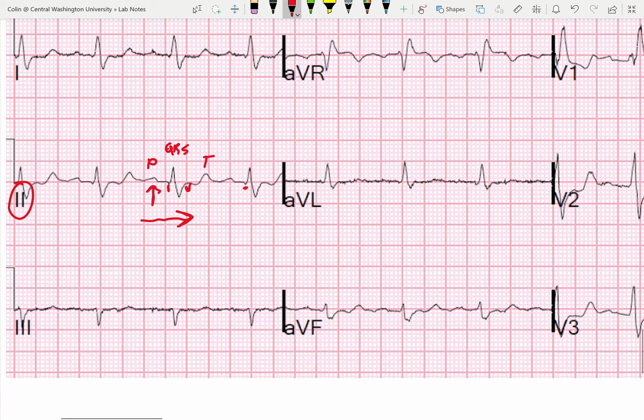The Q wave is just super small. So if you said all I see is R and S wave, no big deal. It'd be easy to miss. And this just comes with time. This is also called 12 lead interpretation, so two of us can look at it and come up with different things. It's not really a science, it's an interpretation. So if you don't think there's a Q wave there, fair enough, we can have that debate.